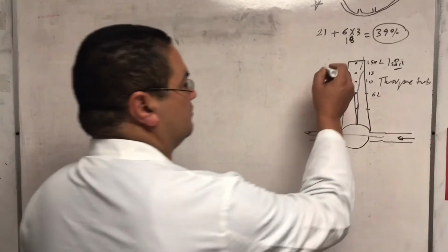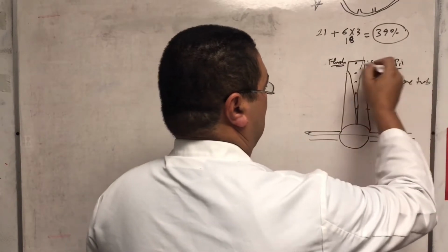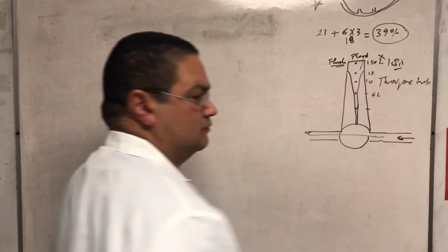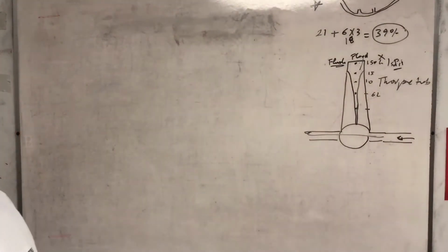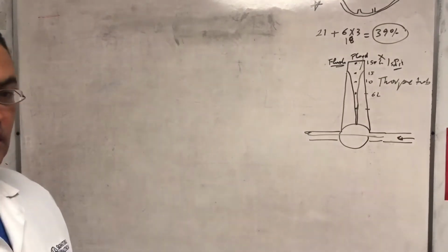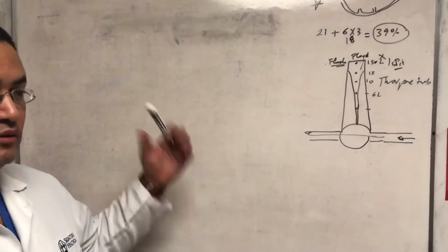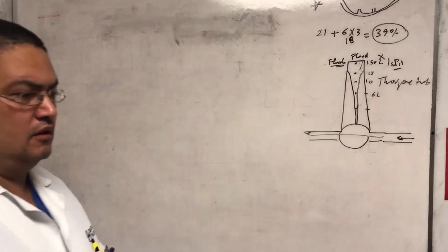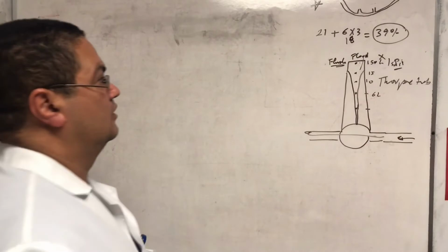And what's written here, written up to 15? Some of them write flush, and we have a mixture. Some of them write flush here, and some of them write flood. And some of them write nothing. It's just that this is flush or flood. So this is important knowledge that you need to keep, because that will fill all the cavities inside the patient's airway, and also come out and will actually make the patient breathe 100% oxygen, and helps with apneic oxygenation, and help oxygenate you also if you're distressed or something.